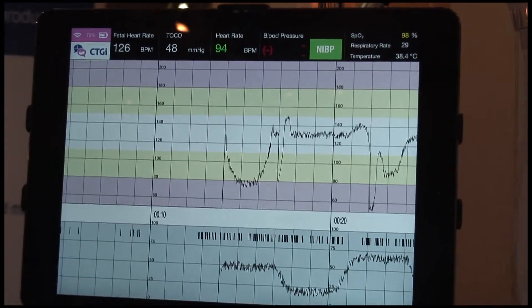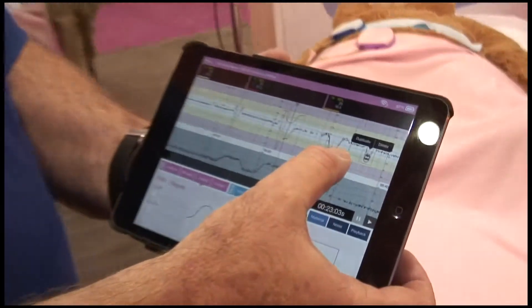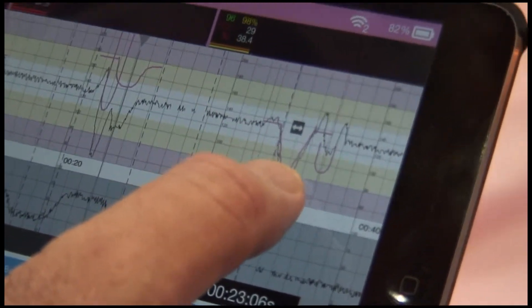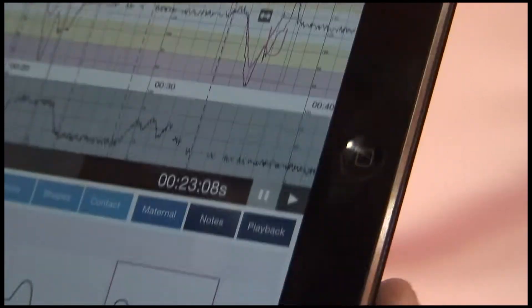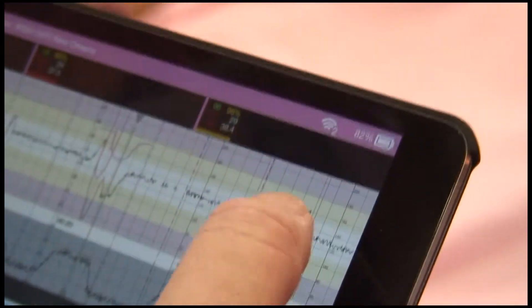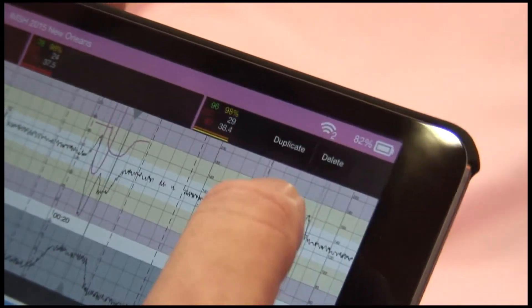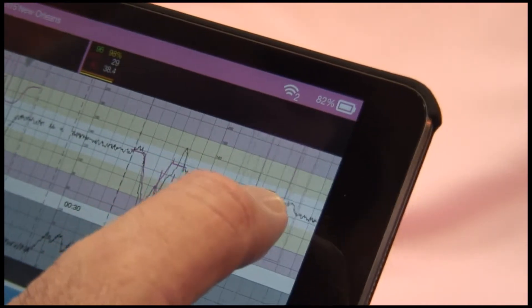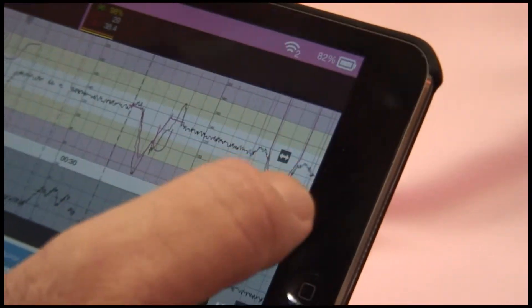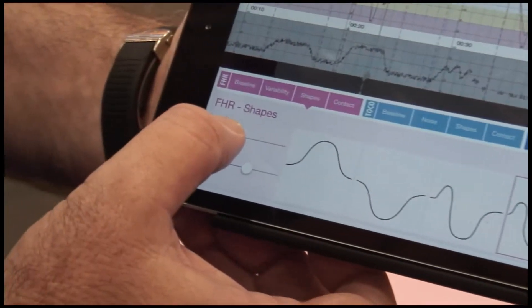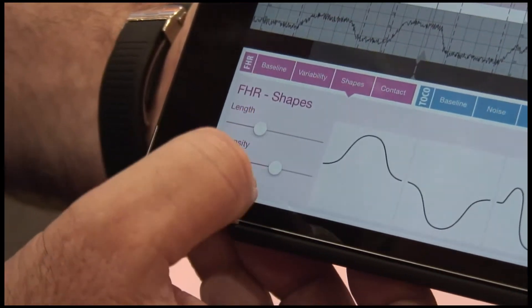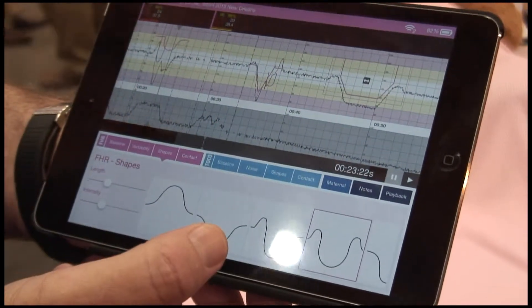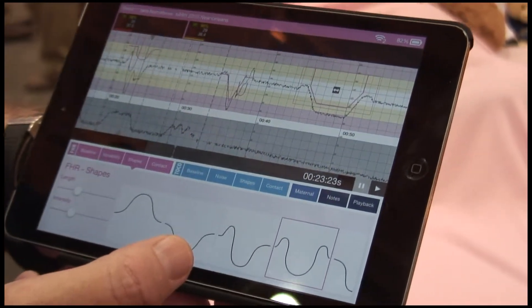To give you an example, if we look at this one here and I'll just slide it along, you can see I can move it, I can intersect it with another one, giving us two shapes. And then what I can do is touch it and duplicate it and then move this waveform along here. I can make it longer, I can make it deeper or less steep. And as simple as that, you've created a new waveform.